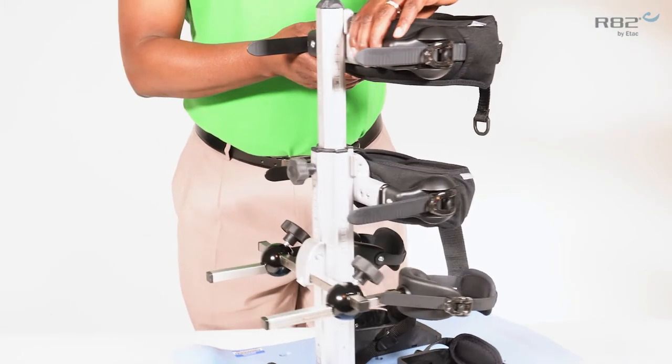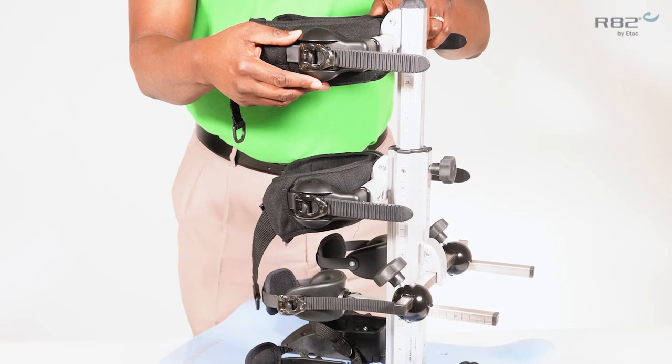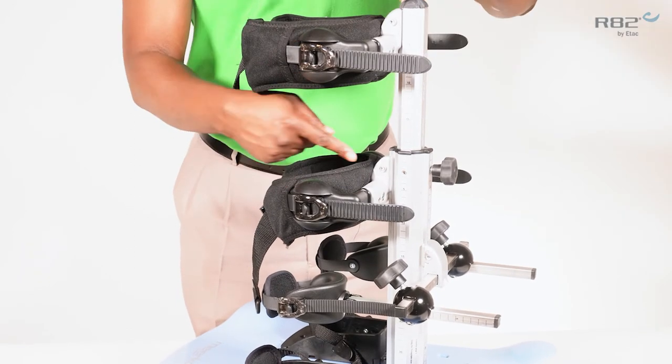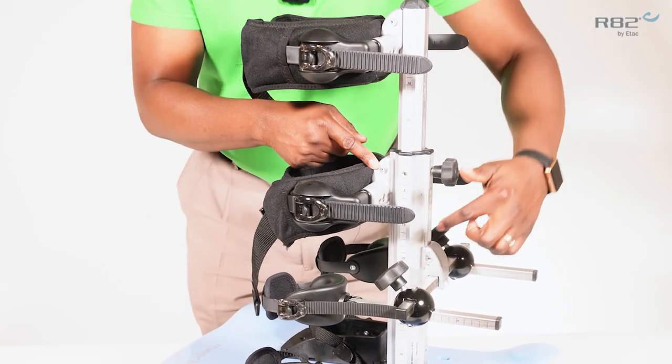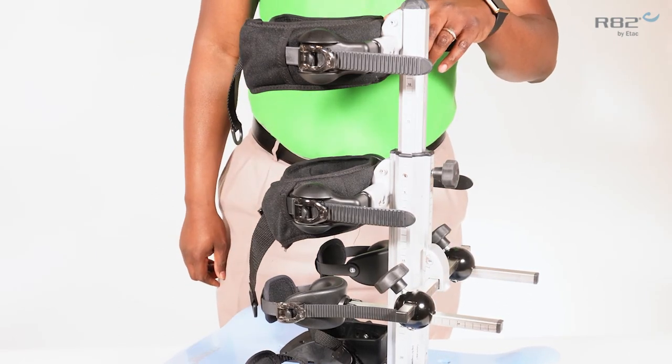If you need additional adjustments with the pelvic and the trunk support, or even the knee support, remember you can always loosen the mounting brackets and adjust each support individually.